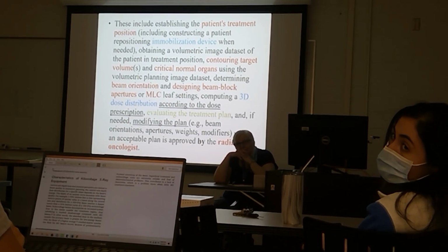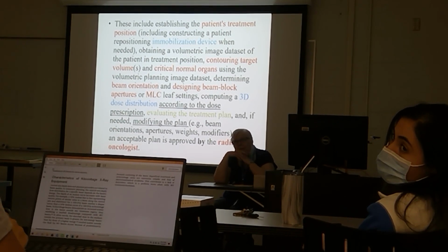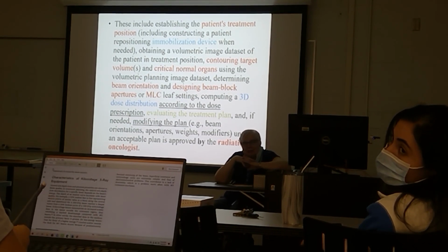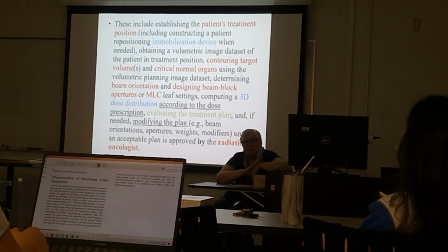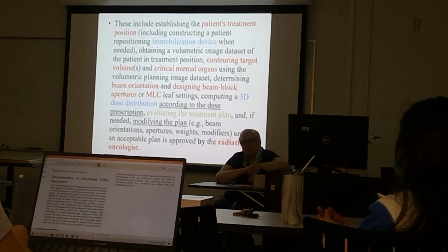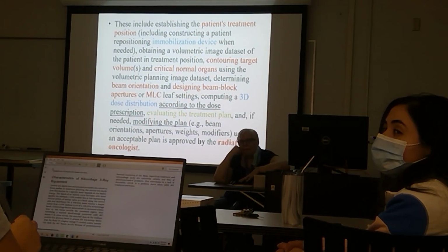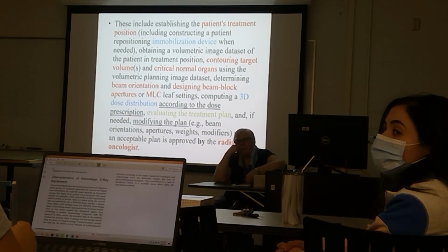I would just have a question about something different, but if you're not done. No, go ahead. Okay, so where I struggle in clinic is after the CT is done and lining up the images. Nobody's expecting you to do that. Okay, and also obviously it looks different than seeing a person standing up and us cut in half and us pointing, oh, this is the bladder, these are the kidneys.